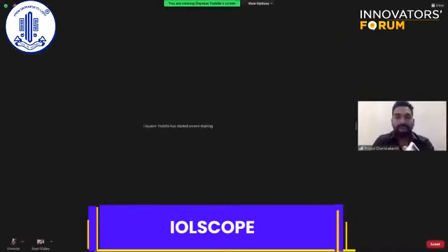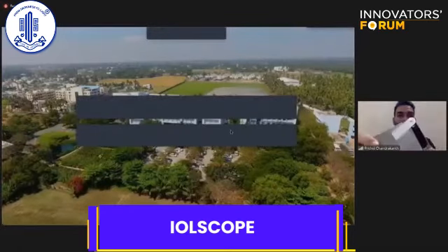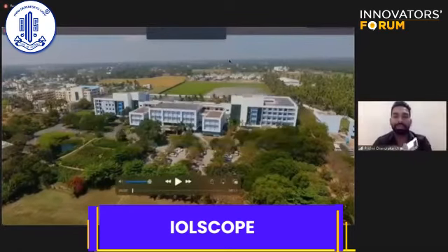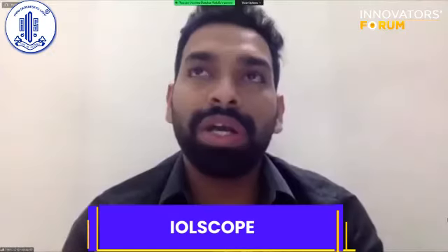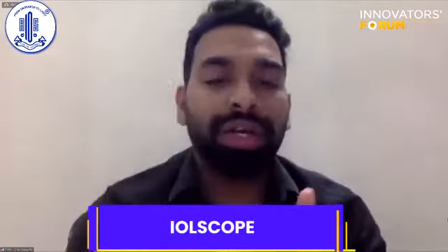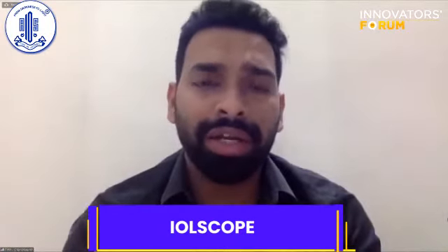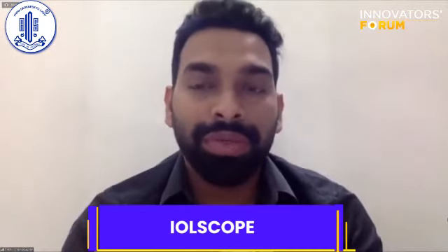So I've used 30 diopter lens IOL of rigid PMMA, and the same thing we have done with this one also. The PMMA rigid IOL has been used. 4 30 diopter lenses were used, and this was actually a 100 diopter IOL, which in air comes up to 500 diopters.